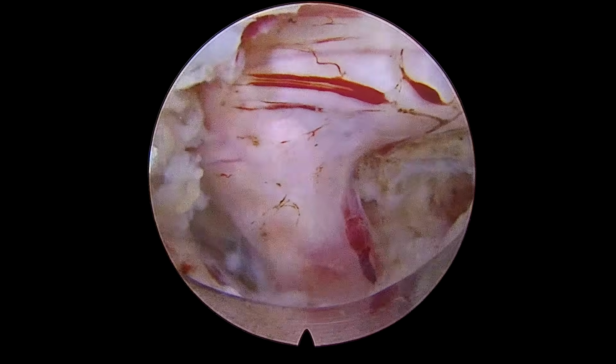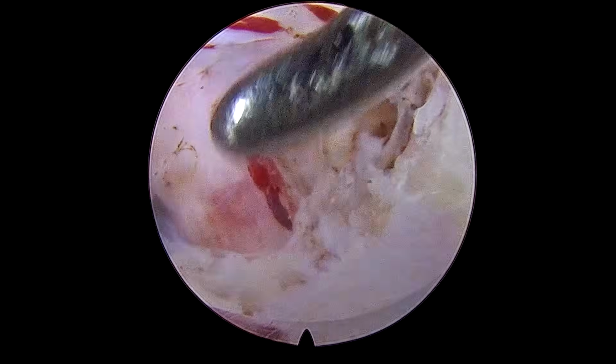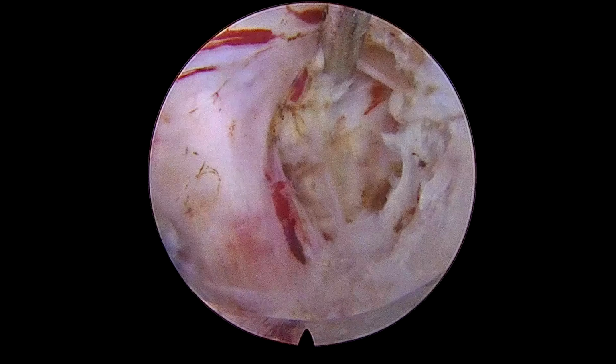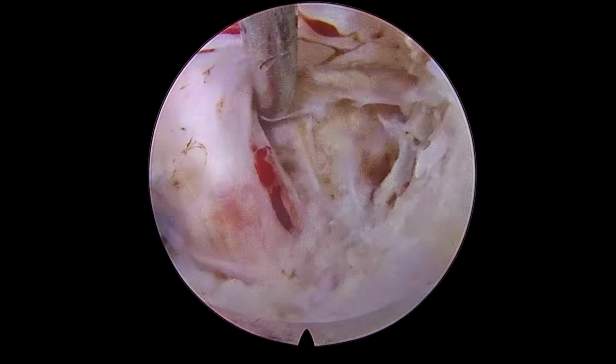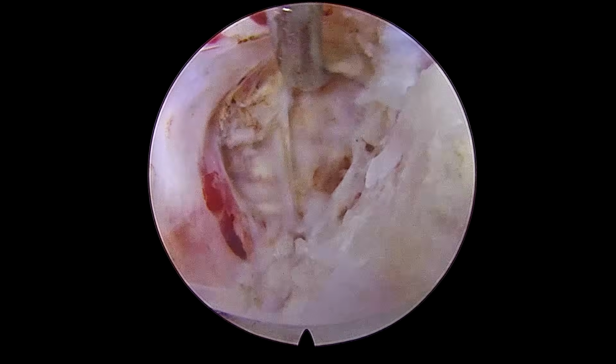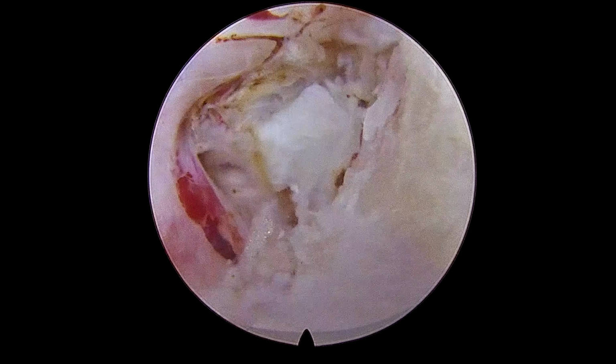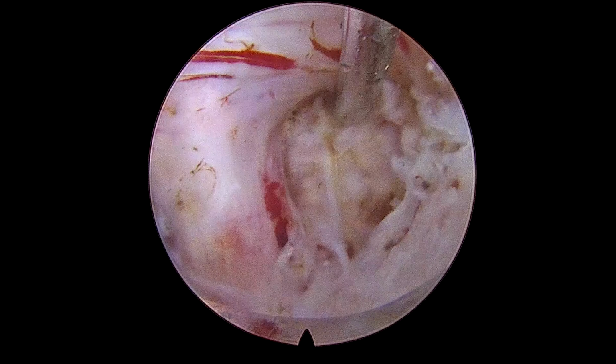I was expecting one single huge fragment here, but the fragments were coming in pieces. Now I can feel the annular tear here, but we are not going to do anything to that annular tear. We're just trying to remove the fragments which are free.